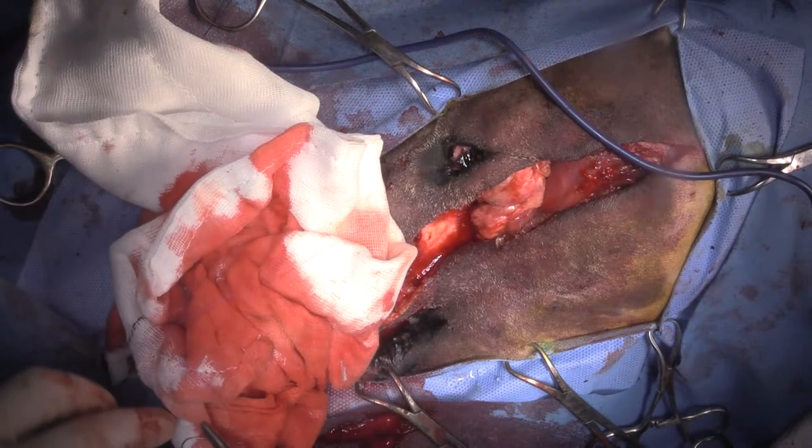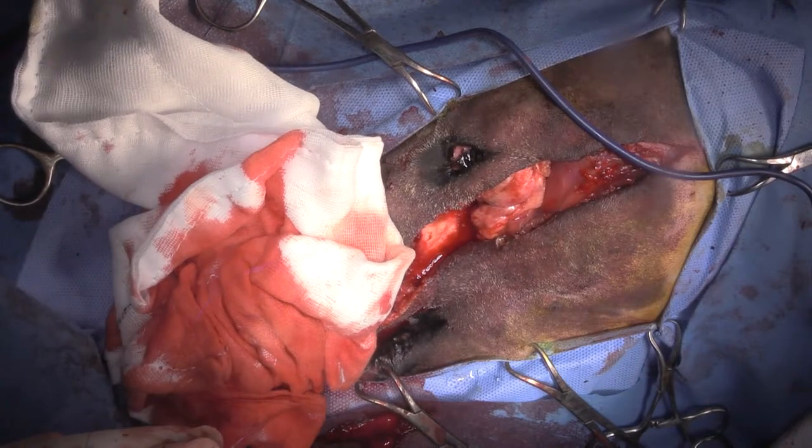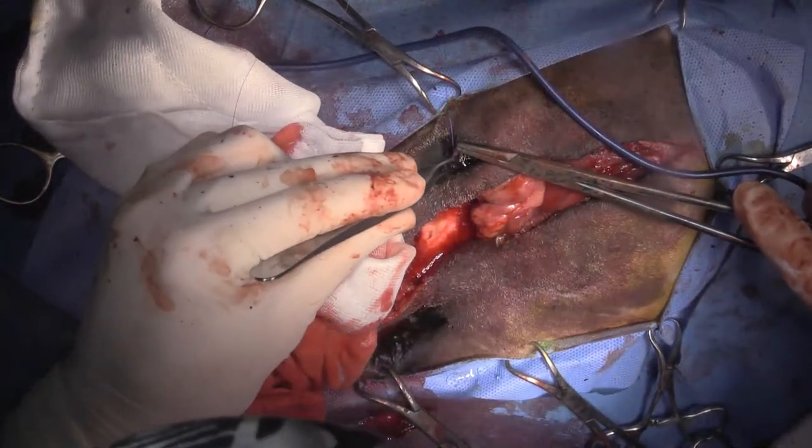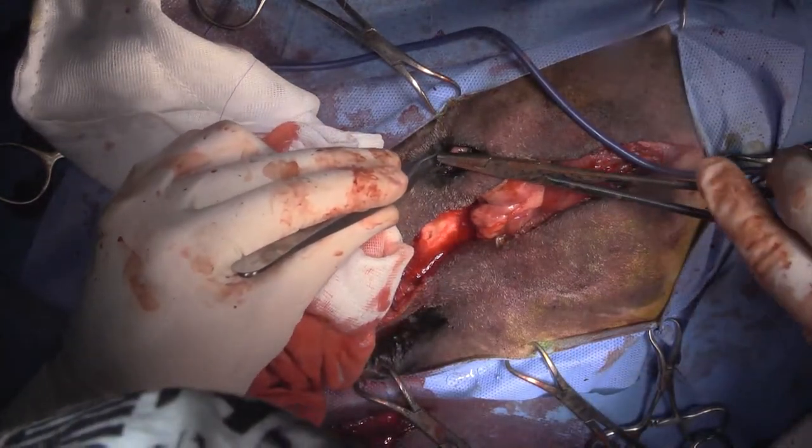And that's pretty much it. All right, so I'm going to go ahead and end the stream. Jeff is just going to do a sub-Q closure and then intradermal, so that should be pretty straightforward.